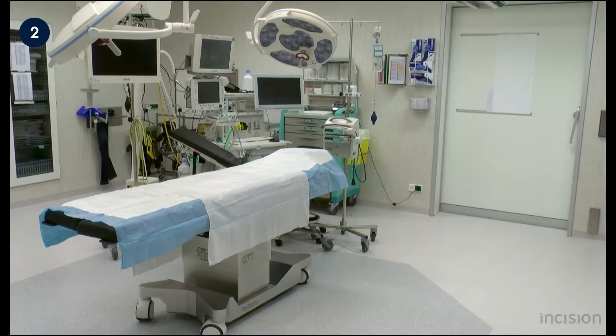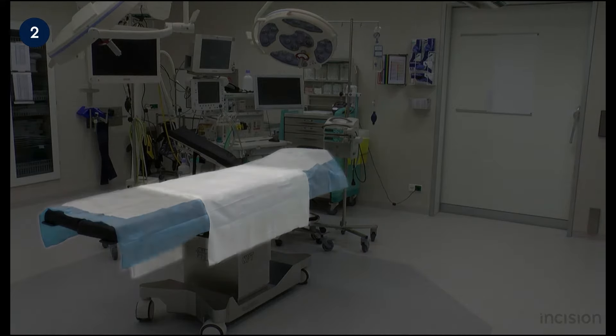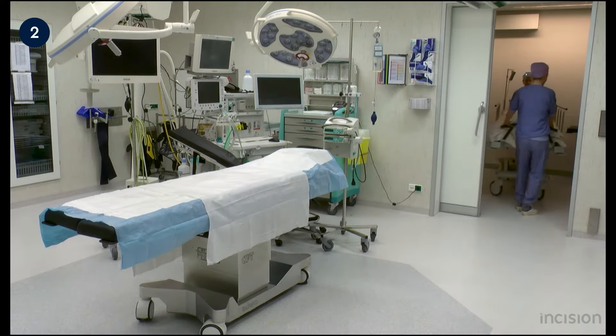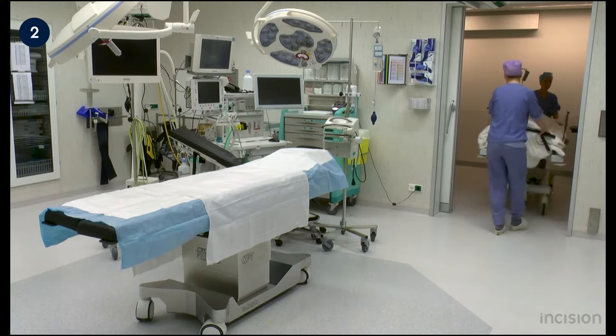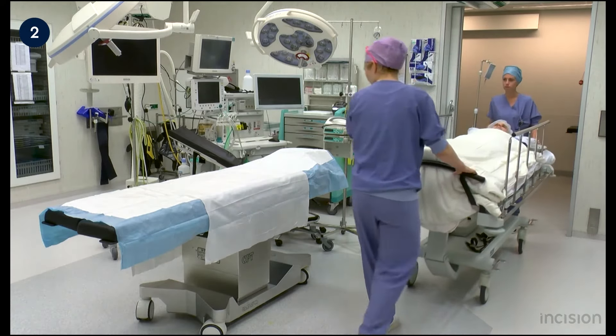The operation table is already prepared. Spread out is an operation sheet with an underlay which can be used to tuck in the arms and transfer the patient to the hospital bed. The patient's bed is manoeuvred inside the operation room and the bed is placed parallel to the operation table.